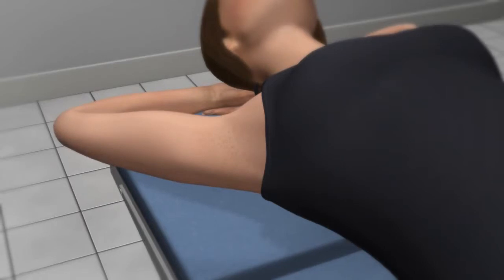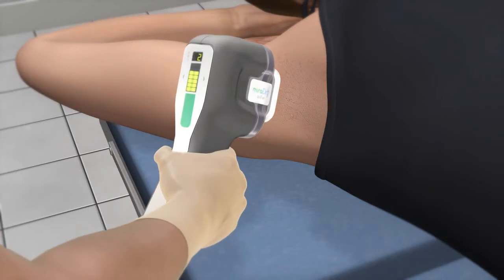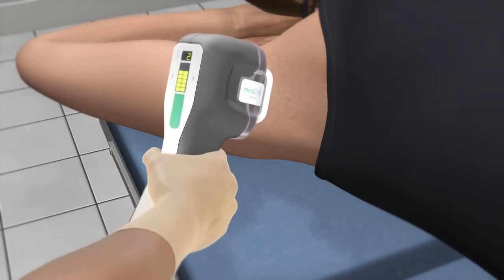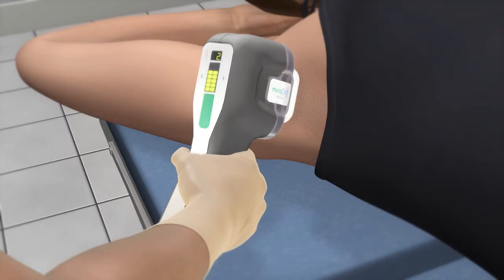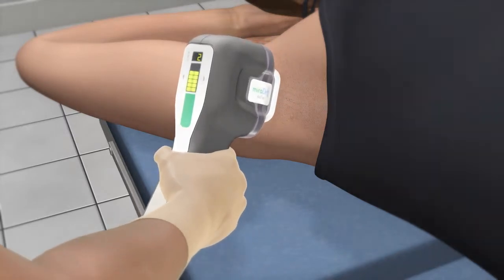The procedure is performed in the physician's office and is non-invasive. No incisions or cuts are involved. The MiraDry system delivers electromagnetic energy to the underarm through the handpiece, which is applied in a repeating pattern on the underarm. This is done after the area has been numbed with local anesthesia.